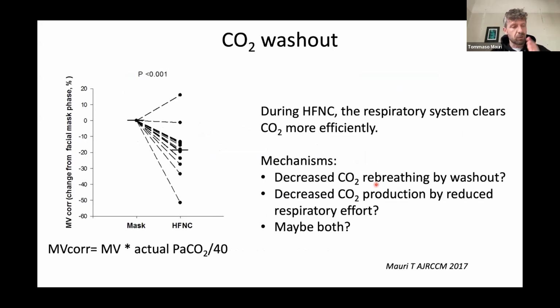And then there is the CO2 side, because high flow is effective both on the oxygenation side and the washout of CO2 side. So you have this washout of the upper airways that decreases the need of breathing of the patient. You can have the same minute ventilation with lower CO2, or the same CO2 with lower minute ventilation, which is the same. So for the same amount of CO2 to be cleared, you need a lower ventilation. This decreases inspiratory effort.